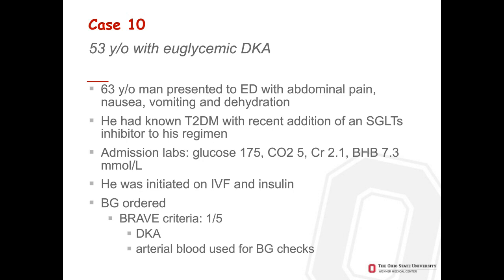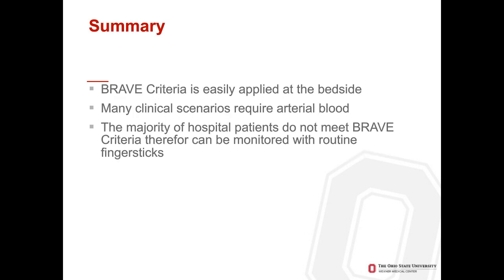So what I've showed you with these clinical examples is that the BRAVE criteria is very easily applied at the bedside. Many clinical scenarios will require the use of an alternate blood source, such as arterial instead of capillary blood. However, the majority of hospital patients do not meet BRAVE criteria and therefore can be monitored with routine finger sticks.